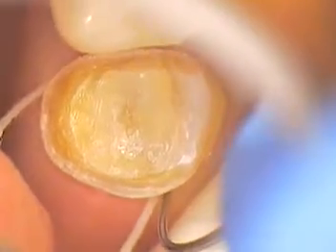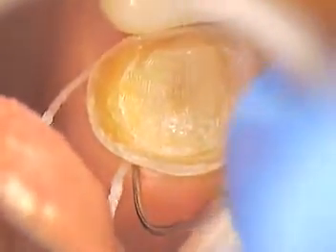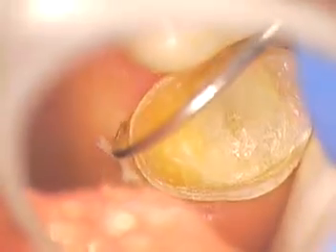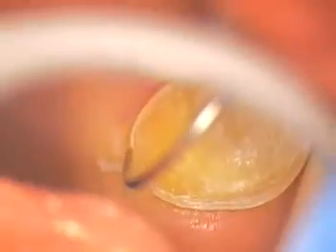The other question was raised, why do I pack cord before I cement a crown, or even leave it in before I cement the temporary? Well, my answer is, again, I don't want to trap any cement. And also, the crevicular fluids that come up from the sulcus, the gingival crevicular fluids, you really don't want them violating and contaminating.